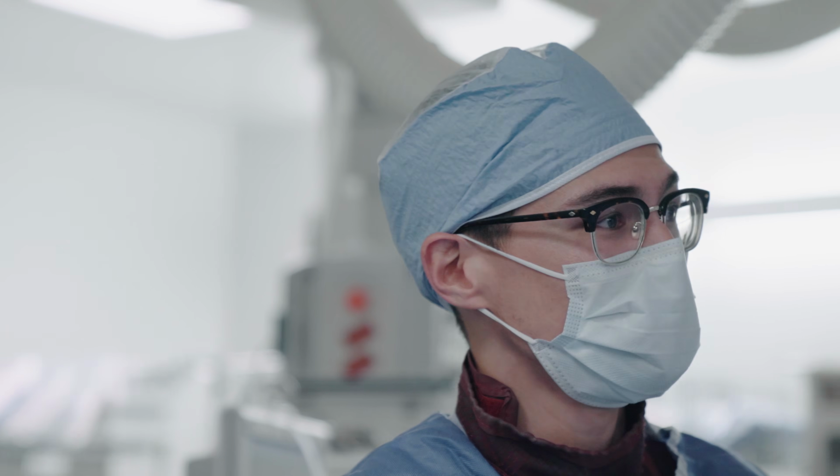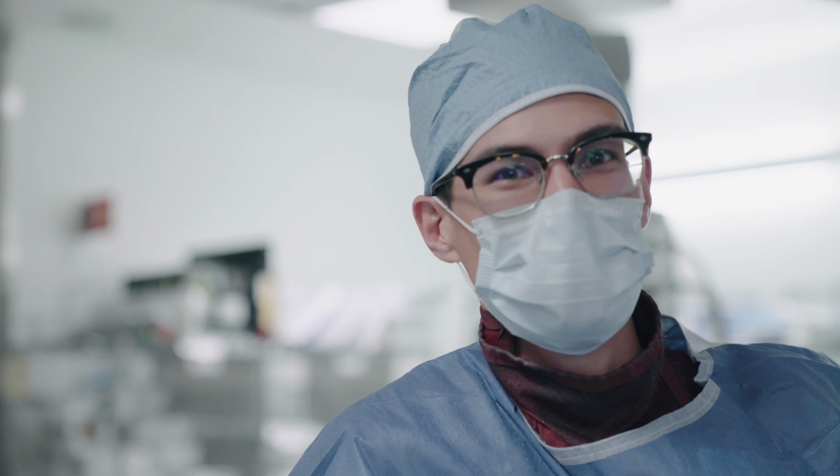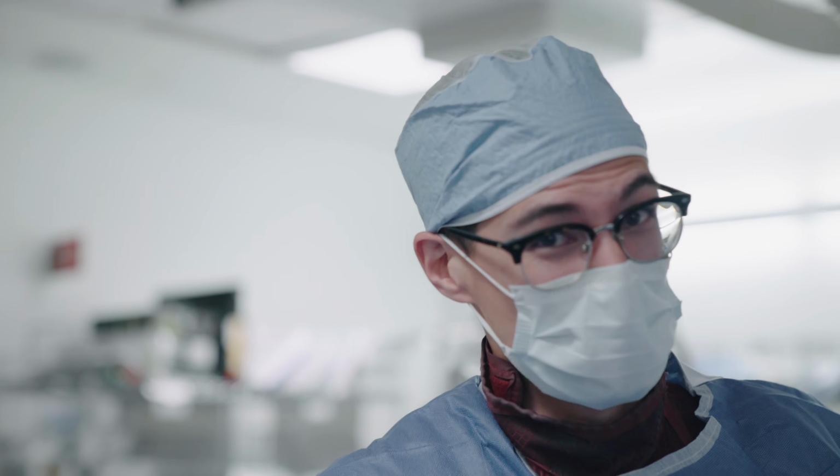Stent graft is deployed. Just going to balloon the tract again. We are all finished. Stent's in place. So we pulled everything out, just holding pressure at the neck to stop bleeding. There's an age-old saying in IR that he or she who punctures shall hold. Dr. John's the one who punctured, so I think he should be holding pressure at the neck. And we'll get our anesthesia friends to wake our patient back up shortly.